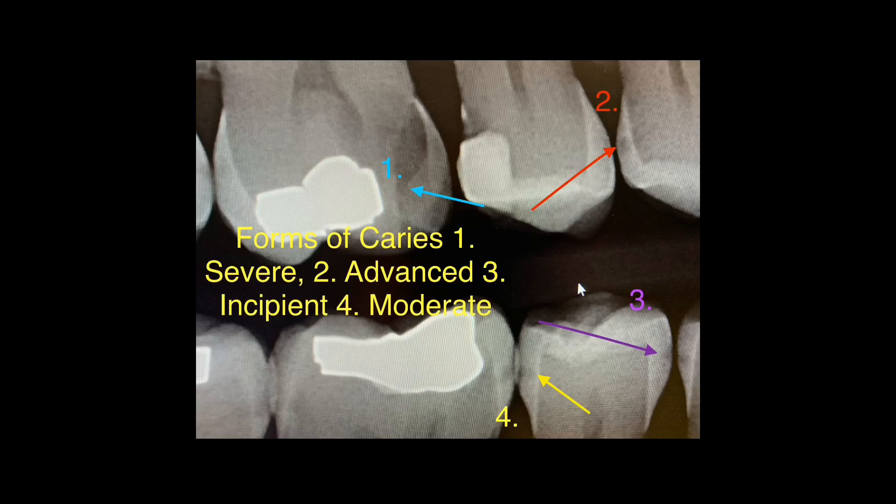In this short clip on oral radiology, I'll talk about radiological features that often come up in clinical judgment exams or other dental board exams. This is one of the most common radiograph types where you'll be asked to identify teeth, locate caries, or determine what type of caries is present. In this clip, you can see various forms of caries co-existing in the same patient.